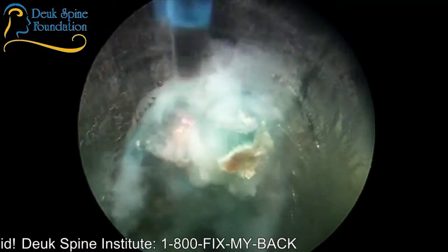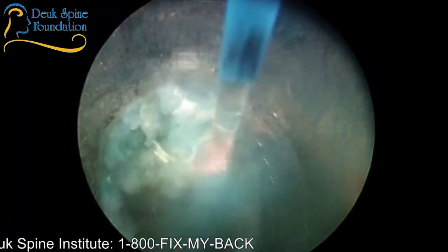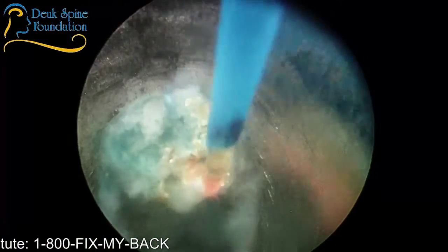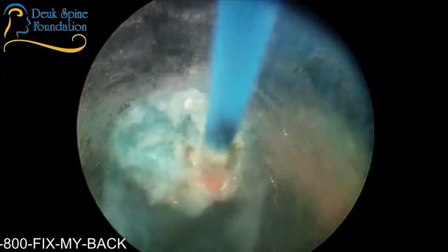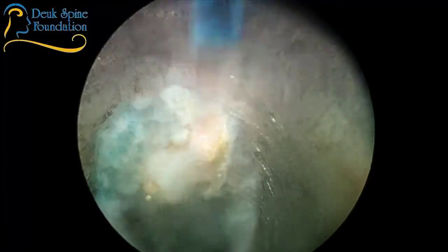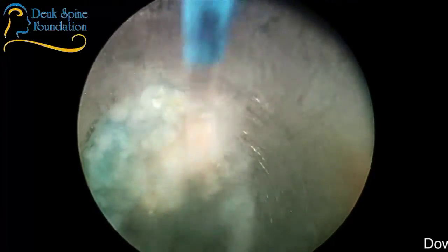All right, we're finished here with this annular tear. This is the last bit. I think we'll be done in about 5 minutes. This is pretty calcified. You see all that gold? That gold color is all calcium, bone spurs, calcification. And of course, this stuff takes a little longer to zap away with the laser.